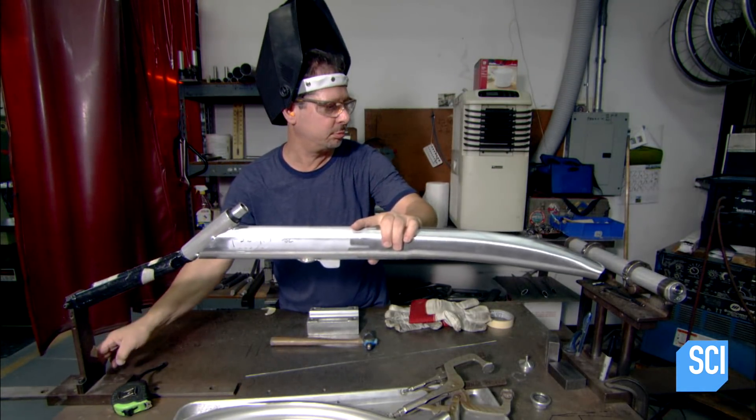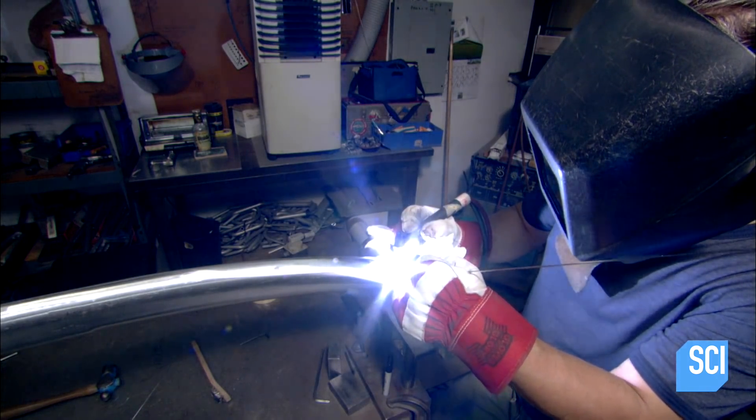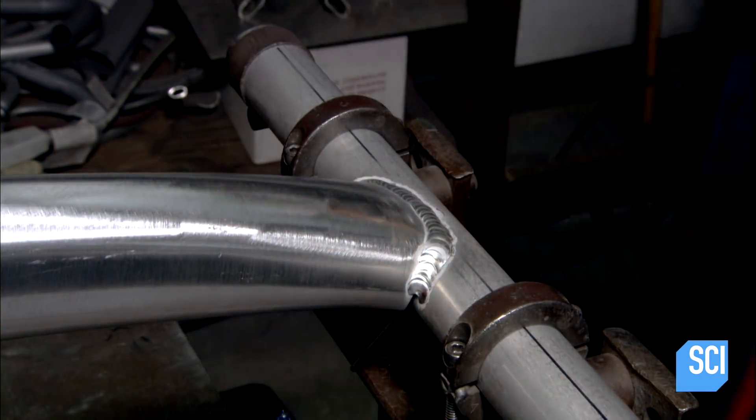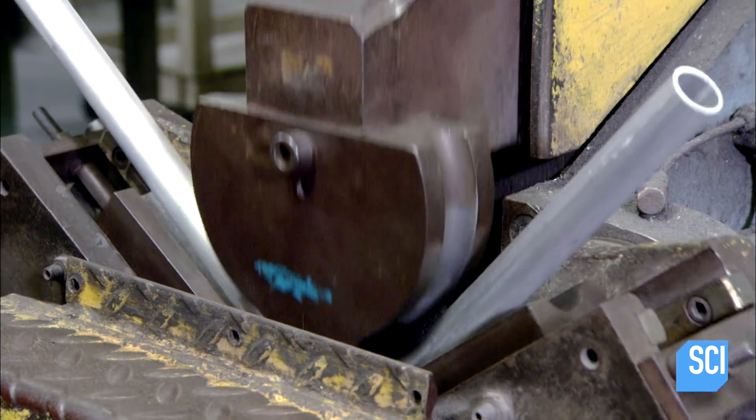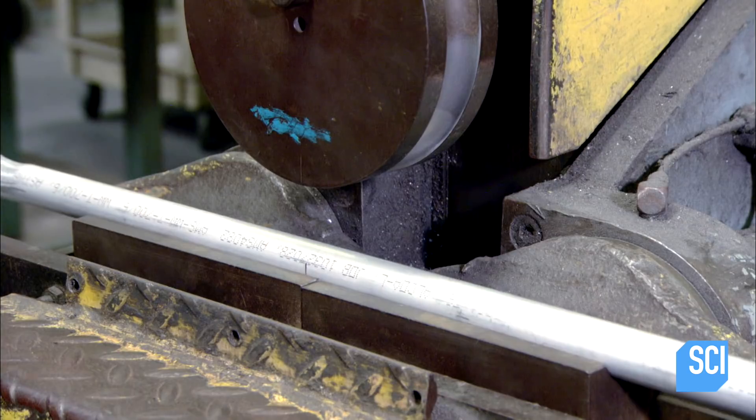The welder now positions the other end of the main tube perpendicular to the wheel axle, and welds the axle to the main tube, giving the framework a T profile. Then a hydraulic machine bends an aluminum tube into a U-shape to make the racing chair's seat frame.